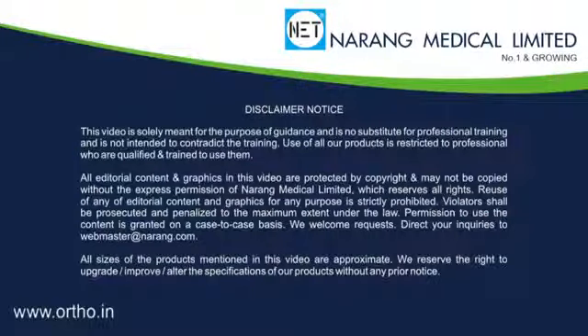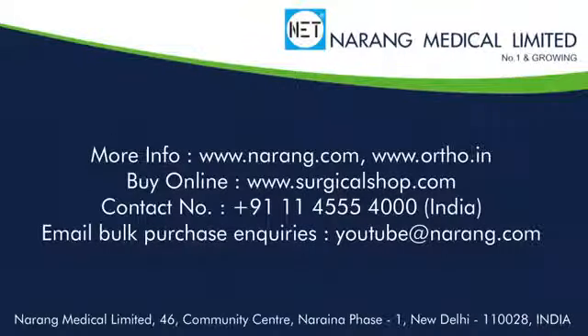For more information, you may log on to www.narang.com or www.ortho.in.